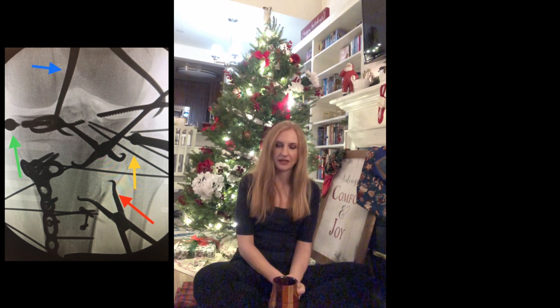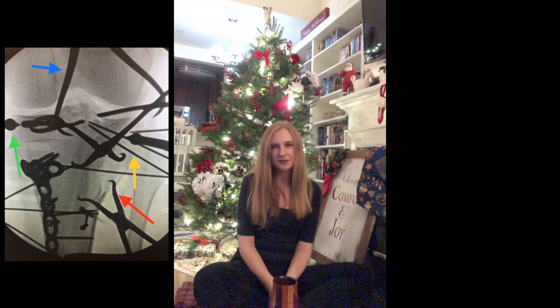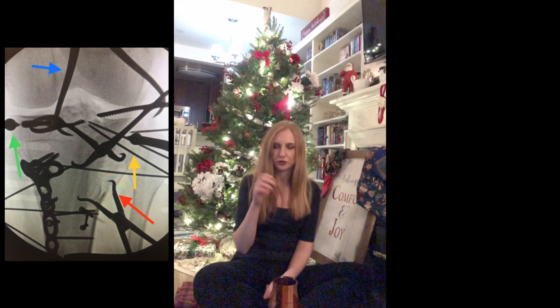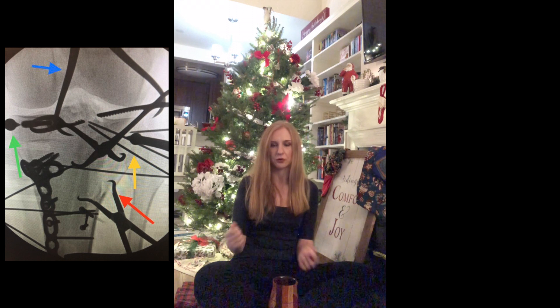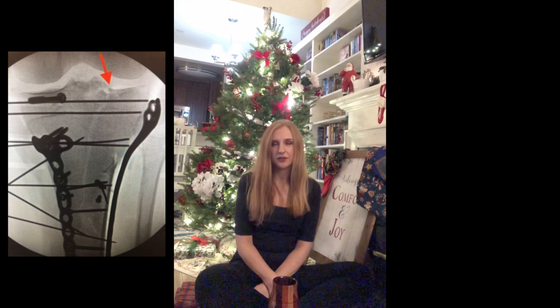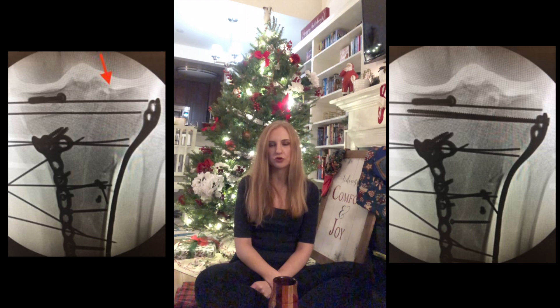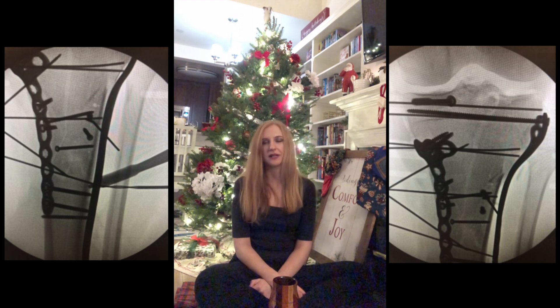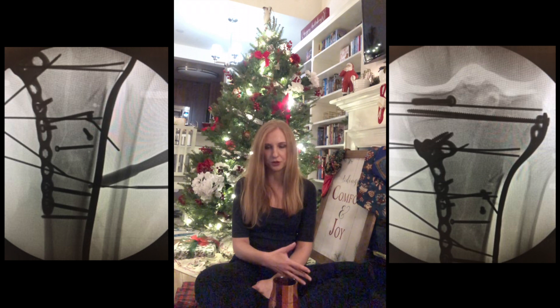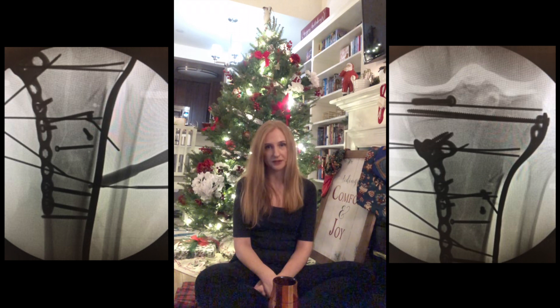In this next fluoroscopic image, you see the various techniques used to hold the plateau fracture in place, including periarticular clamps and K-wires. My smaller clamp wasn't large enough to compress sufficiently by itself, so I put a larger clamp onto the handles of the smaller clamp to increase its reach. Then you see the plate finally going on — what I typically do at that juncture is suck it down to the bone using proximal and distal cortical screws. This is another trick from the plateau webinar: use cortical screws at the articular portion to get the plate down, then later replace with locking screws.